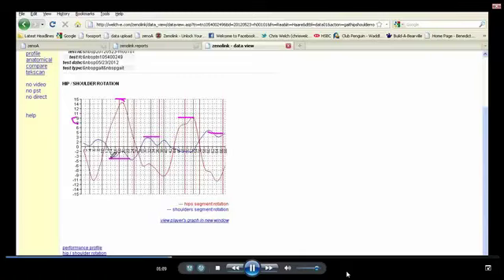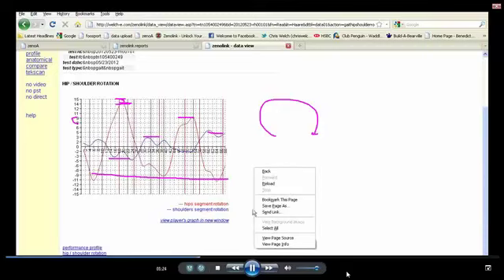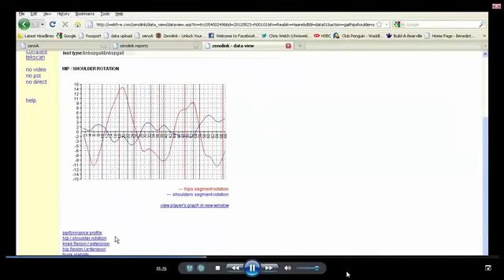And the other thing is that we'll see that we have more rotation clockwise towards the right side than we do towards the left side. So the left side, we don't have quite as much rotation of the pelvis. So we have some asymmetries as well as some over-rotations, but generally have some basic counter-torquing, which is good.